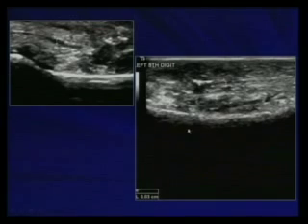So with these modern ultrasound machines, we can check for very thin nerves. Look at this. This nerve is just 0.3 millimeters. So it's the third part of a millimeter. One French? Okay, one French. So this is a very thin structure.